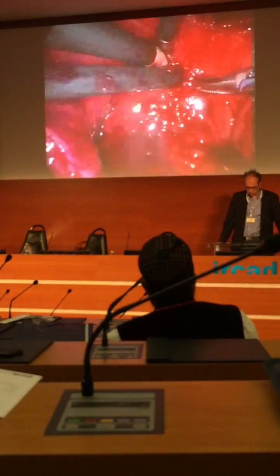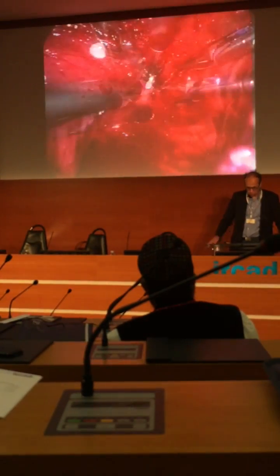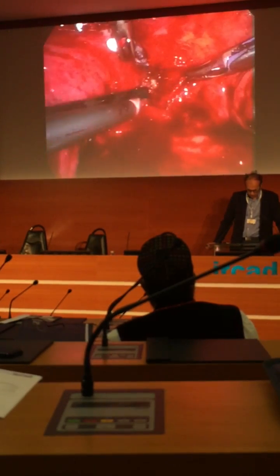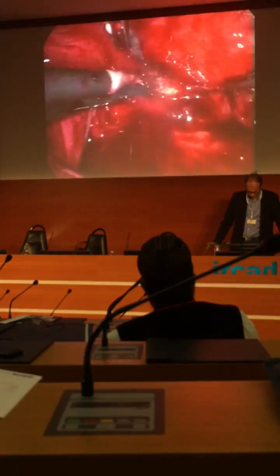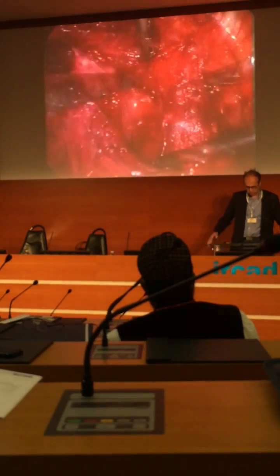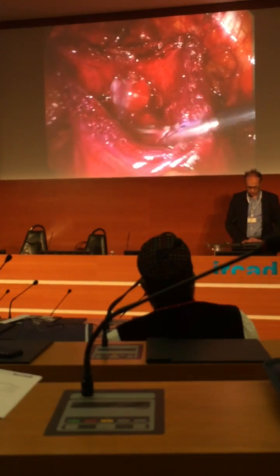This can be discussed, and you can also incise the bladder neck by an endoscopic approach later on, or in a first step. It depends. Because as you can see, you do not have a very good vision there. So maybe the endoscopic approach is better, but it needs a second surgery, of course.